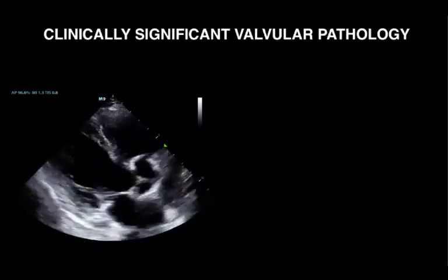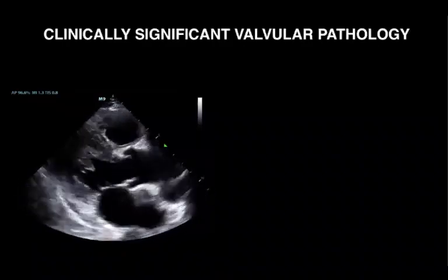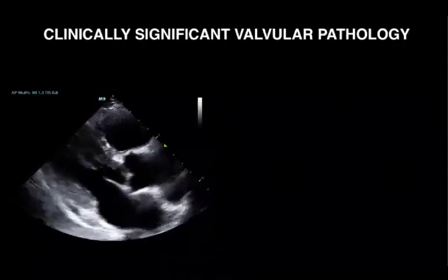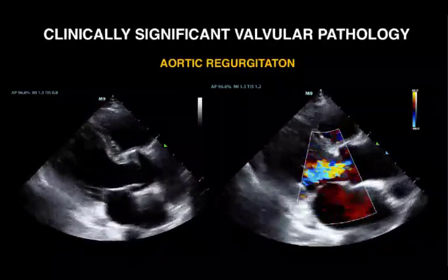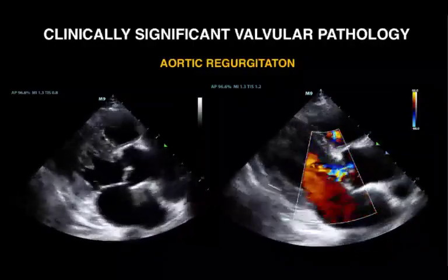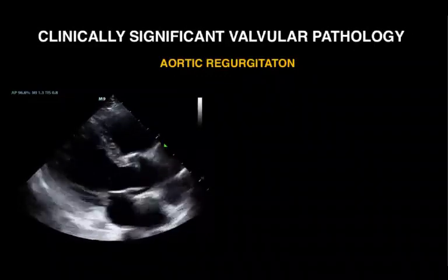So I'm going to give you one example just to prove this concept. This patient that our team had, we're looking at this, and everything looked fine, right? But the patient was really hemodynamically unstable. And there was a very good reason that we were able to see once we put color on that valve. You don't need to be a cardiologist to see this massive jet here. So that's aortic regurgitation, and that is easy to be picked up just with some color. And again, not really visible without a color over that valve.